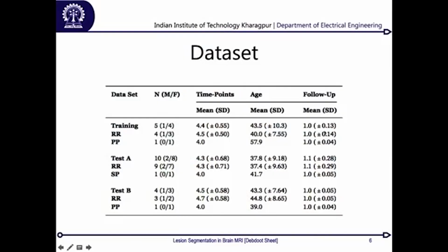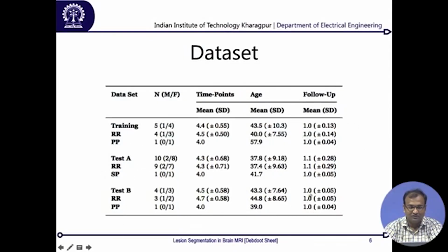That's what comes out as a follow up, and then you repeat this kind of longitudinal scan again. This follow up is typically about a year. You have the same thing for your testing cases as well, and this gives you a very clear idea of the way in which your timestamp data was distributed longitudinally.